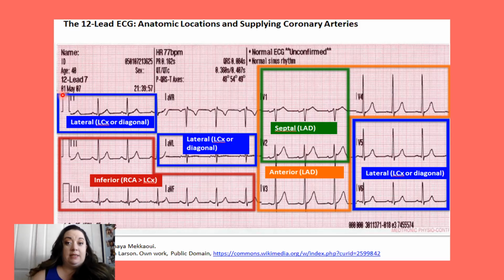And then if that patient becomes a STEMI, it's still kind of the same process. It's going to get faxed to a physician. ER is nice because the physician's right there. With med surg or tele, you might have to fax it over to a physician, but my patient had a symptom, it fit that criteria. I did my 12 lead, I handed it off to a physician. Especially if I look at this thing, I don't know a whole lot, but there's ST elevation all over it and it says MI. Yeah, I might start doing that stuff ahead of time, even while that physician's still confirming.